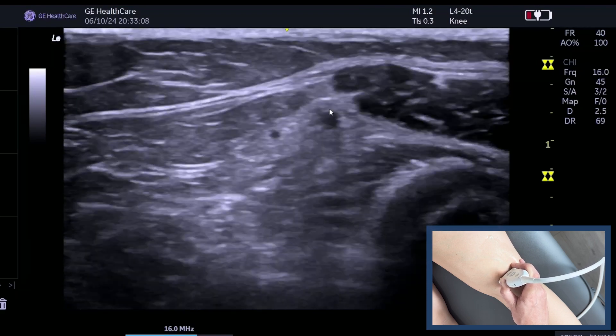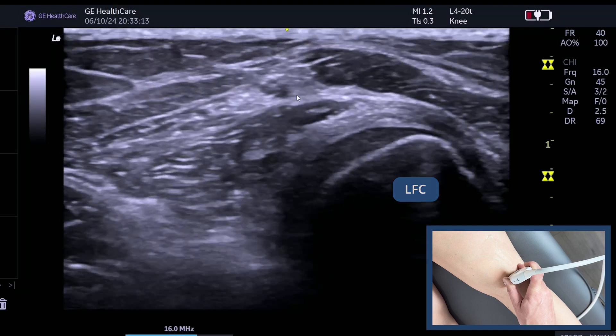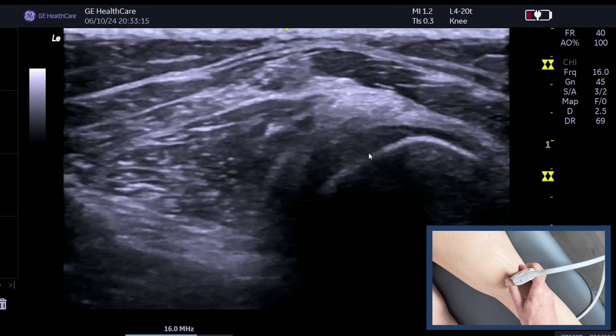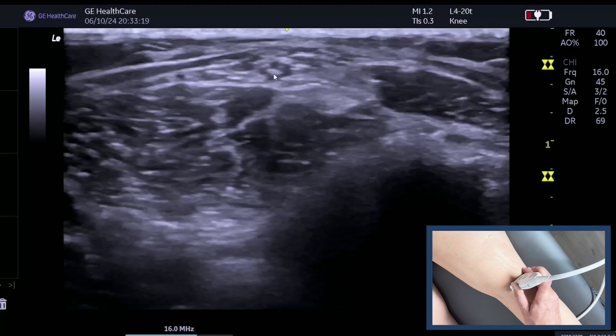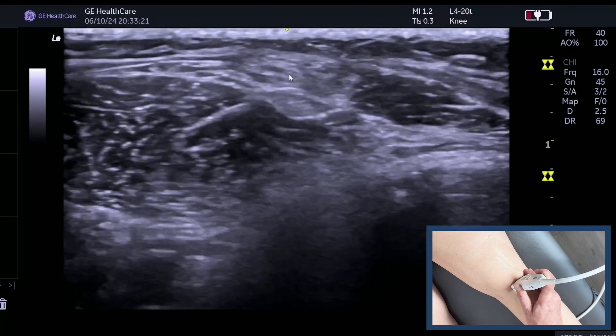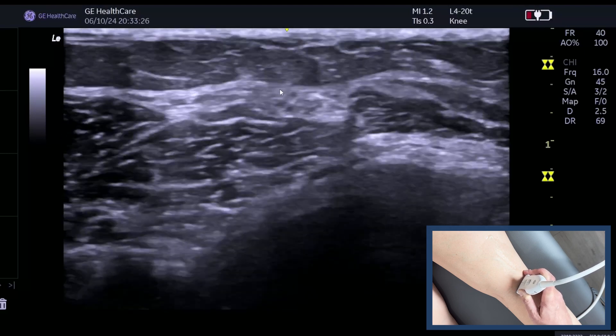So here we go — this is the common peroneal nerve. Keep tilting — there you can see the fascicles within it and the small artery there. This is the short head, this is the lateral femoral condyle because that's articular cartilage, and as we follow it round you see it's extremely superficial, so it does make itself prone to blunt trauma.